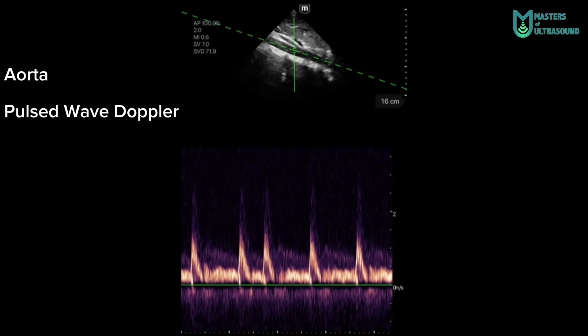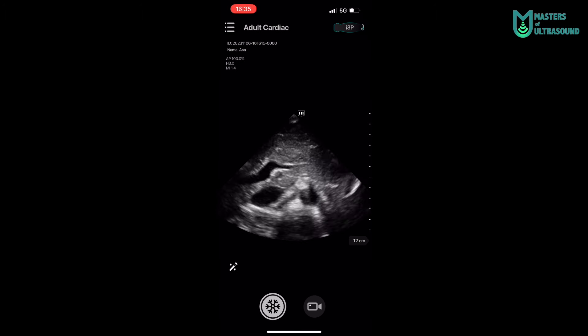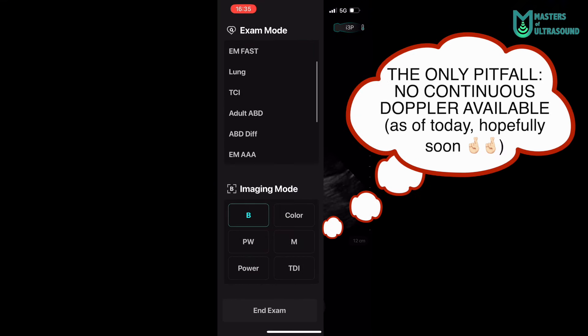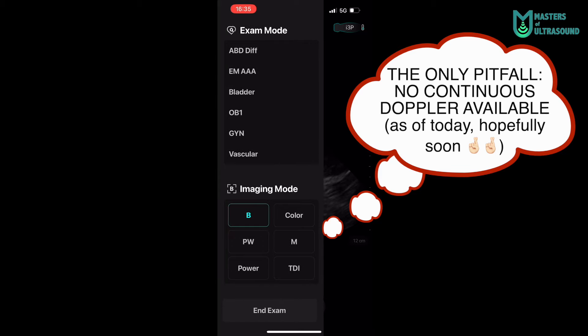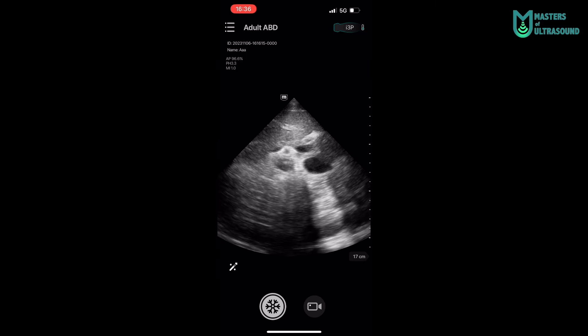Here you can see the renal arteries emerging from the aorta. You can see at the left the different exam modes and imaging modes that this device has: B-mode, color doppler, pulse-wave doppler, tissue doppler, power doppler, and M-mode.